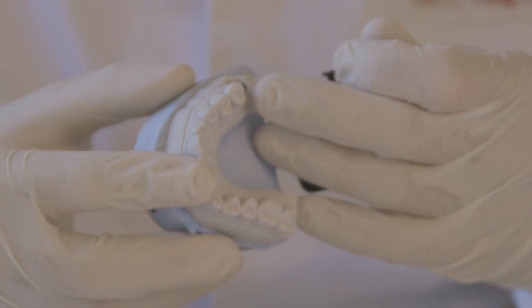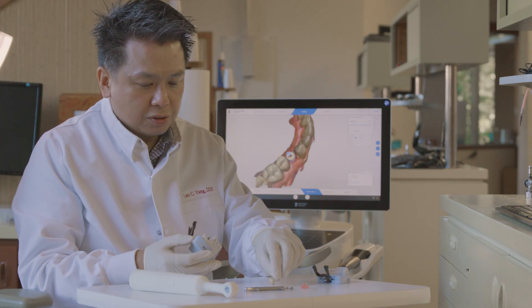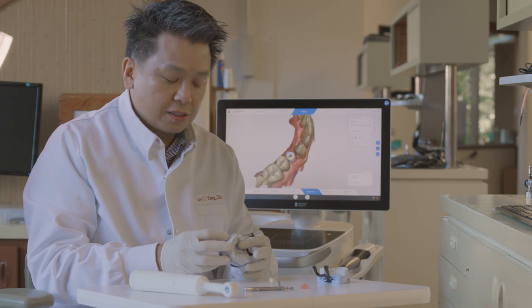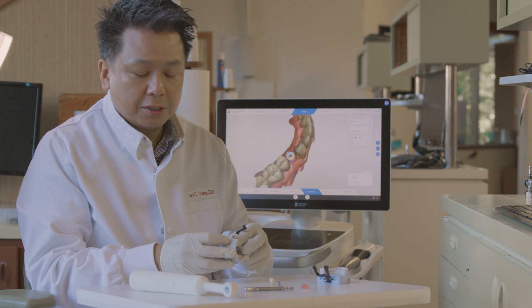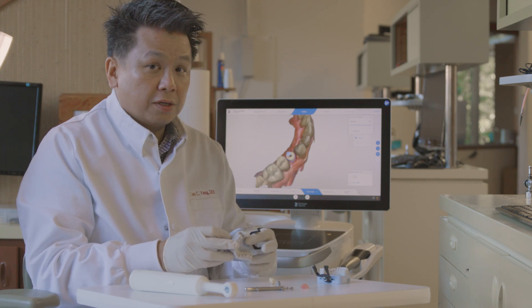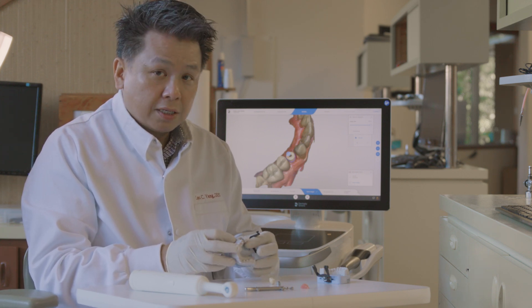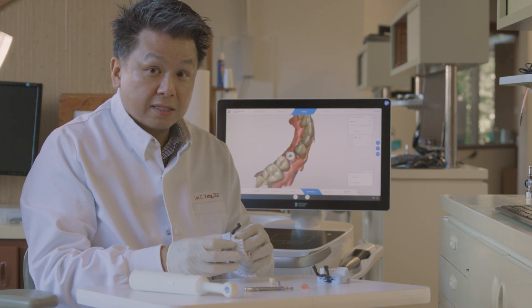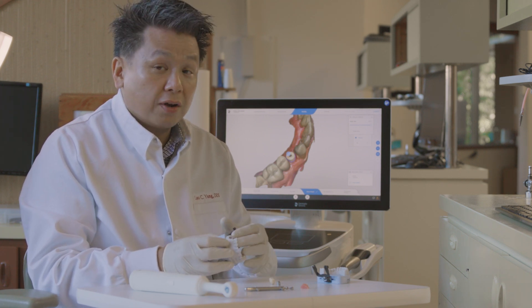Now in the mouth, of course, you're going to torque it down. In this case, I'm using a Stroma bone level implant, and the torque specification for this is going to be 35 Newton centimeters. If you are using different implant brands, please check with the manufacturer regarding what the torque specs are. In this case, it's 35 Newton centimeters.